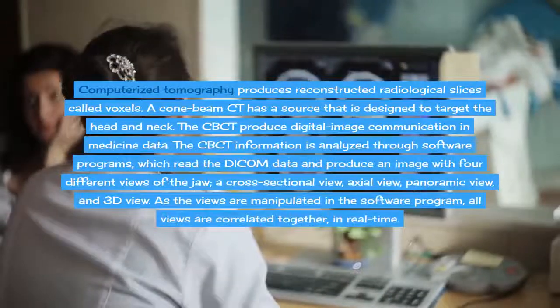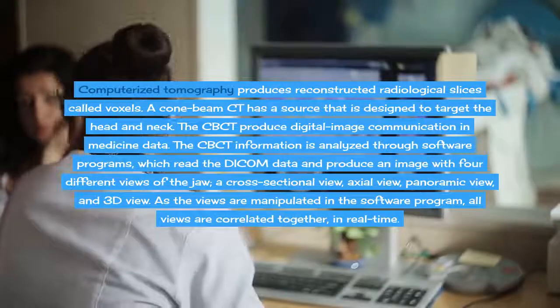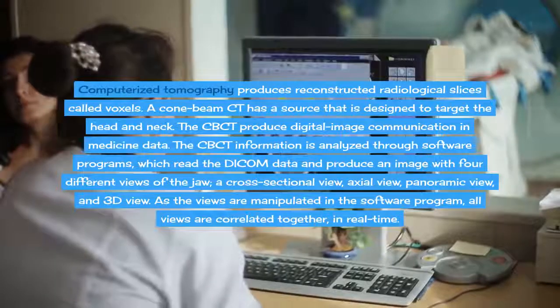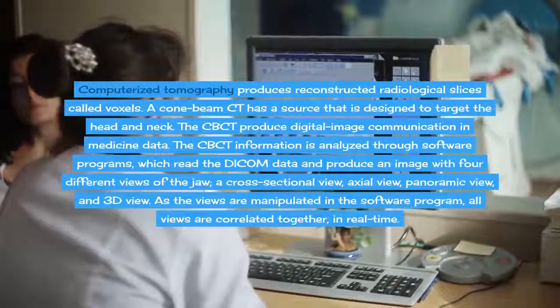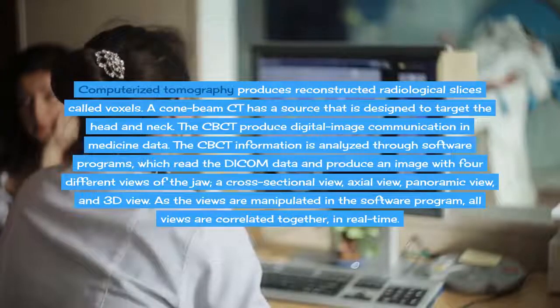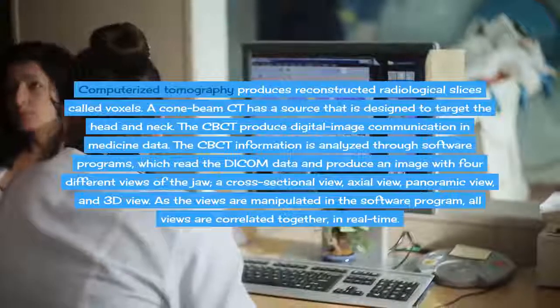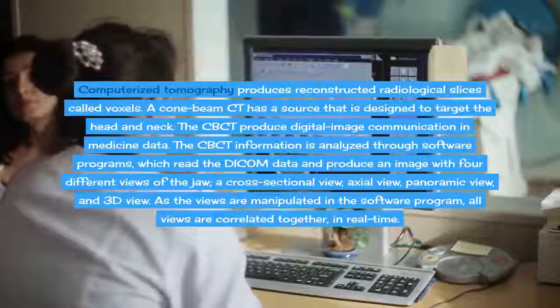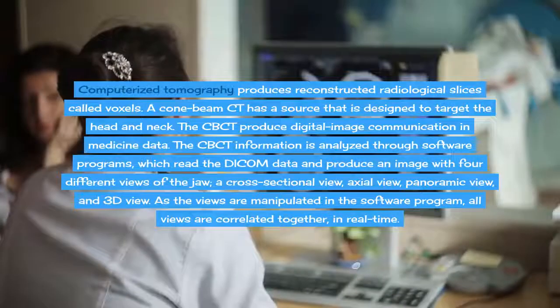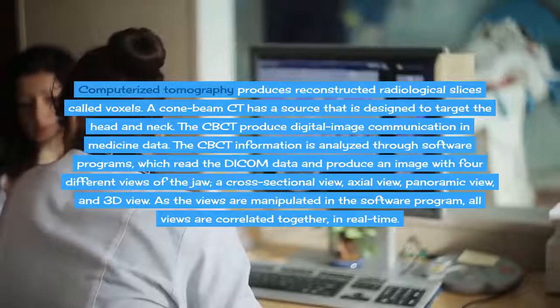Computerized tomography produces reconstructed radiological slices called voxels. A cone beam CT has a source that is designed to target the head and neck. The CBCT produces digital imaging and communications in medicine data. The CBCT information is analyzed through software programs, which read the DICOM data and produce an image with 4 different views of the jaw: a cross-sectional view, axial view, panoramic view, and 3D view. As the views are manipulated in the software program, all views are correlated together, in real time.